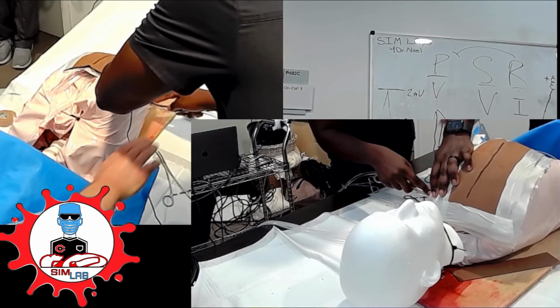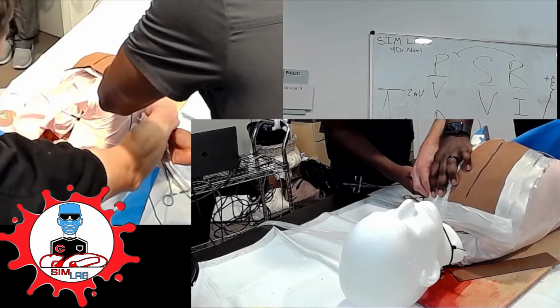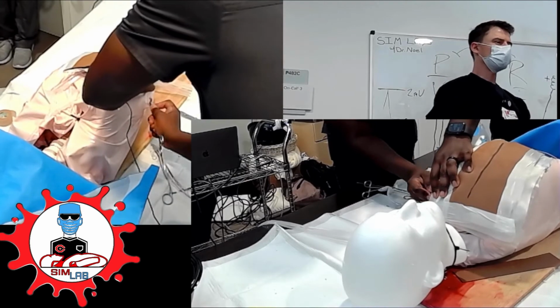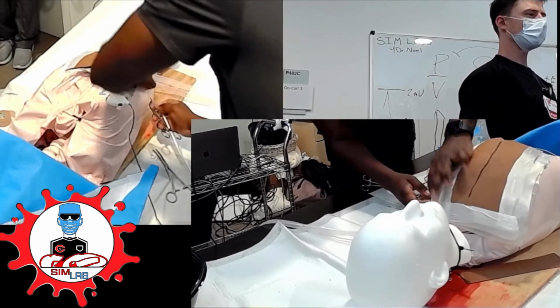You go this way. Put it over, and then guide with your finger. So if you don't have a big enough incision, just make it bigger. Once you're in this space, then you're going to come off with your Kelly, and then just feed it in.